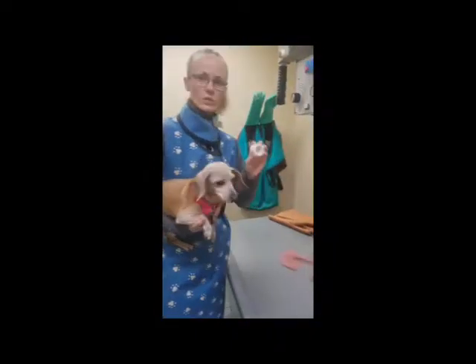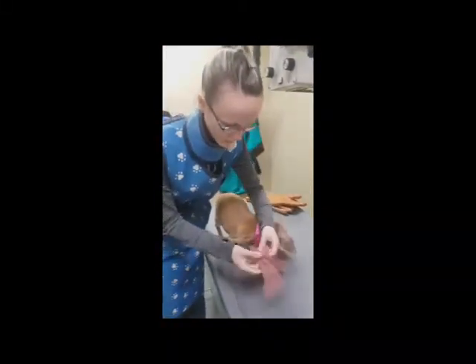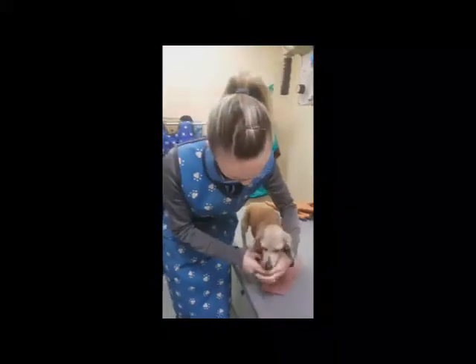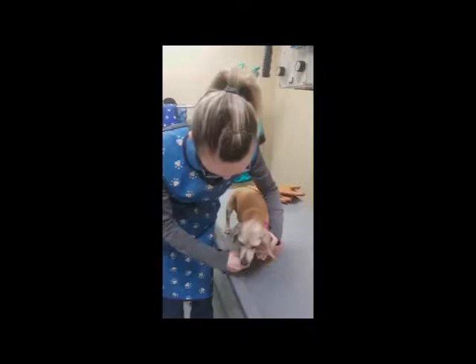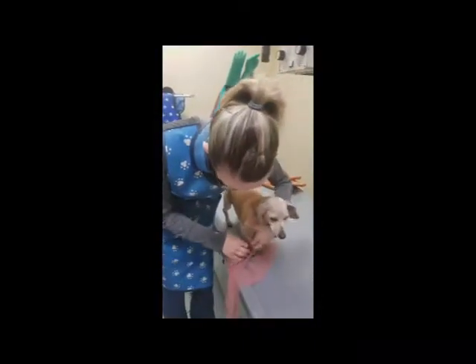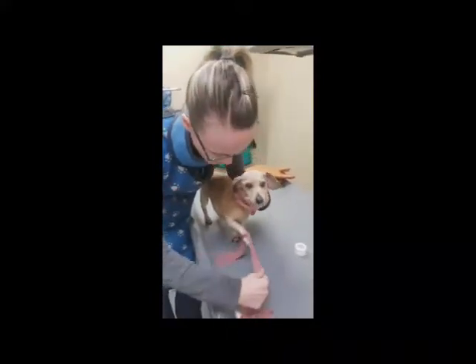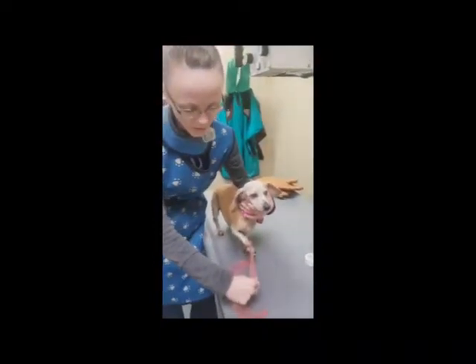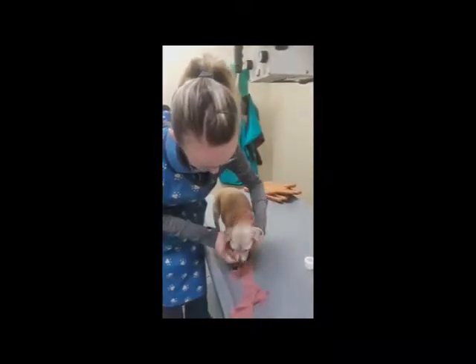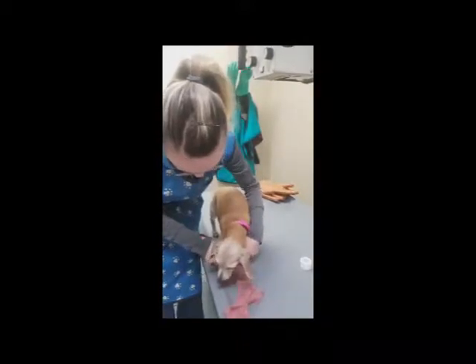The next tools are roll gauze and white tape. With the roll gauze, if you're doing a limb picture, you take the roll gauze and put it around their foot. This allows you to take their arm and stretch it out so your fingers aren't going to make it into the picture. It's a lot safer for the person taking the x-ray.